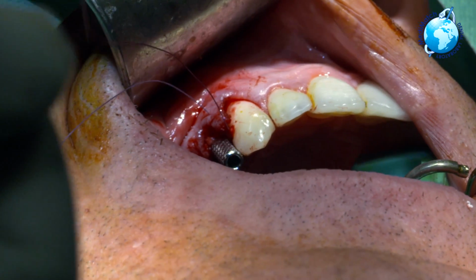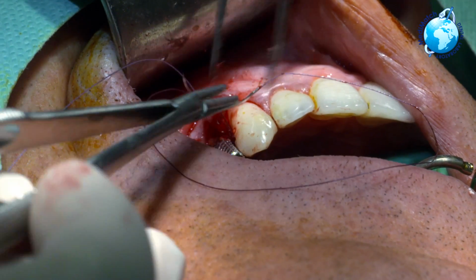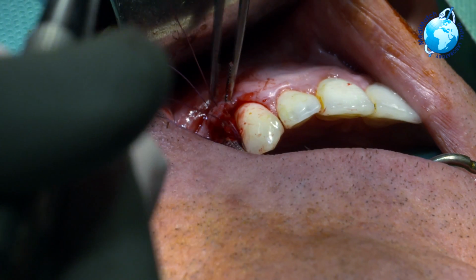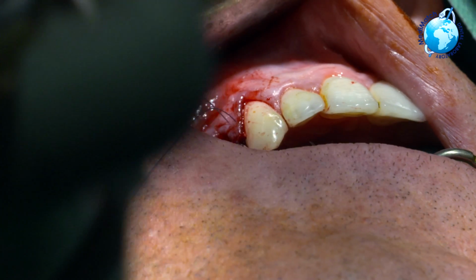Okay, so what we're doing is a vertical cross mattress now, just to hold your papillae up. The papillae should nicely form anyway there. Okay, and there we go. Just tie that off in this direction.